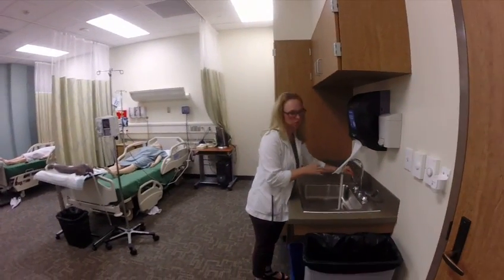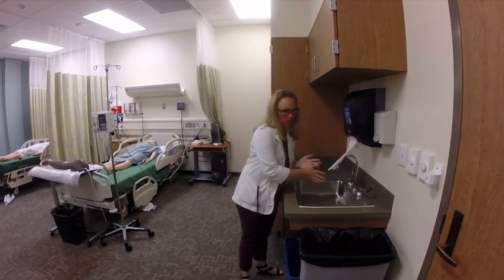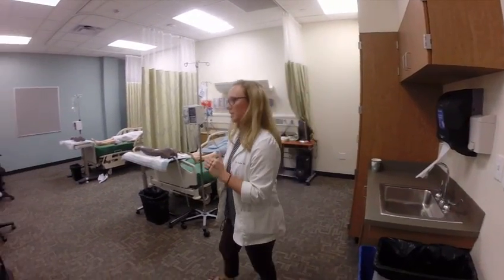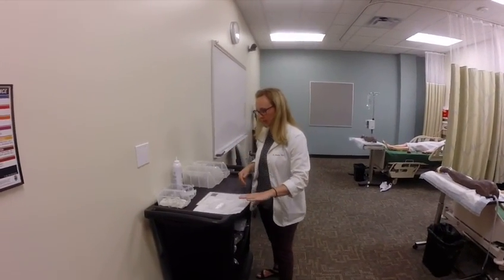So first thing I'm going to do, wash my hands. If you're really skilled at multitasking, you can do both patients at the same time. I'm going to demo breaking them up one at a time. So I want to do my primary IV fluid.